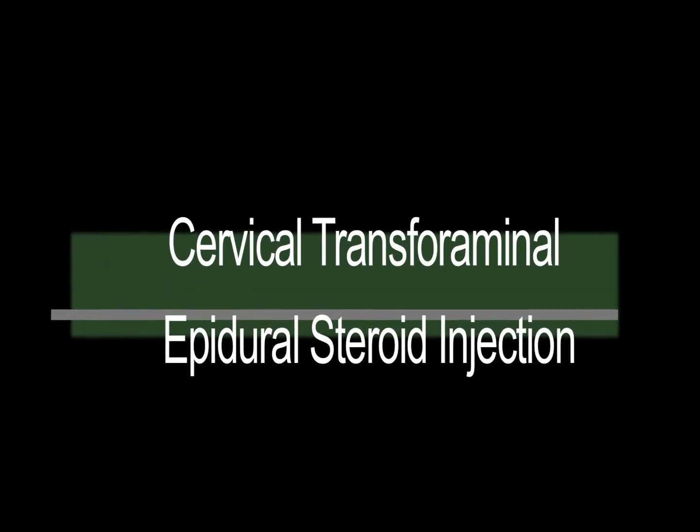Also, for those of you who are here for a cervical injection, either into the cervical facets or a cervical transforaminal epidural steroid injection into the neck region, I wanted to tell you that basically everything is exactly the same. You can see here when we use our model, this is a model of the cervical spine, again would be roughly about like this on me.